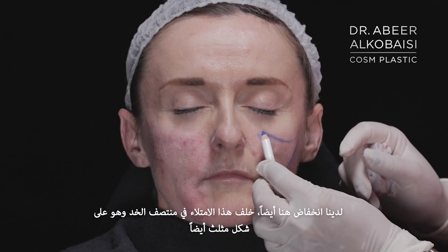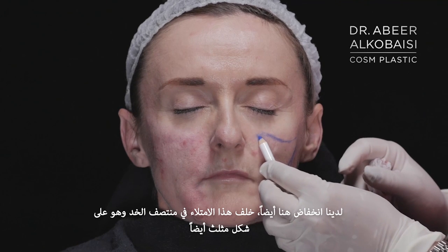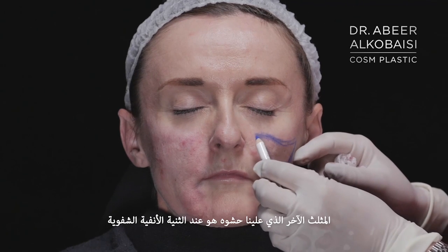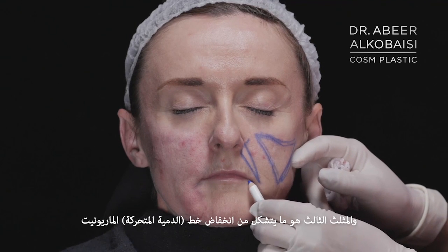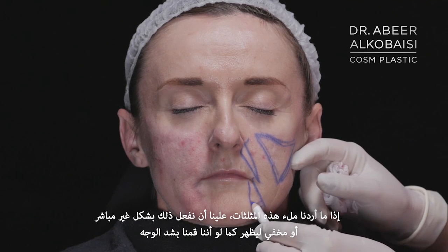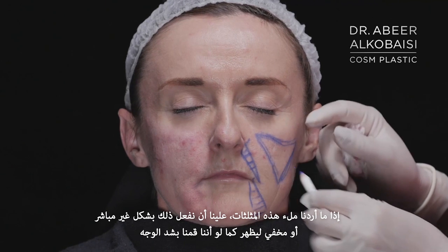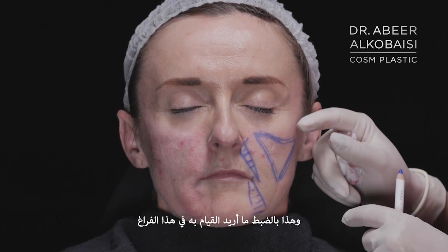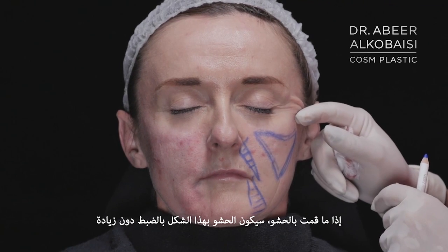So again, we have a depression here, just at the back of this fullness, and just in the middle of the cheek. So again, it's a triangle. The other triangle that needs to be filled is the nasolabial fold. And the third triangle is the depression of the marionette line. If we try to fill in these triangles, we give an indirect, or we give a camouflage, as if the face has been lifted up. So that's exactly what I want to do with this hollow. If I do the filling, it's going to get filled exactly this way, not more.